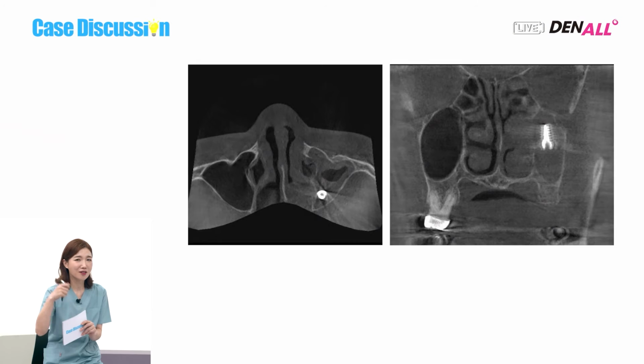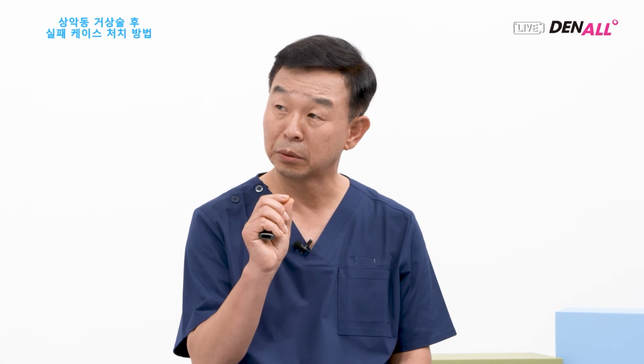In this case under discussion, when you open the window laterally, what instrument do you use? In general, after opening it laterally, I use the suction tip. Using the negative pressure, it is removed. Therefore, the suction tip should be thick. Suction is switched off at the lateral window, moved into the sinus, and then turned on. After you rotate it, due to the negative pressure, the implant would be suctioned out.